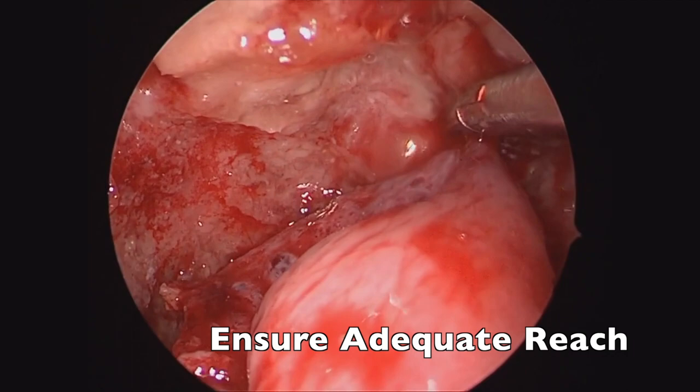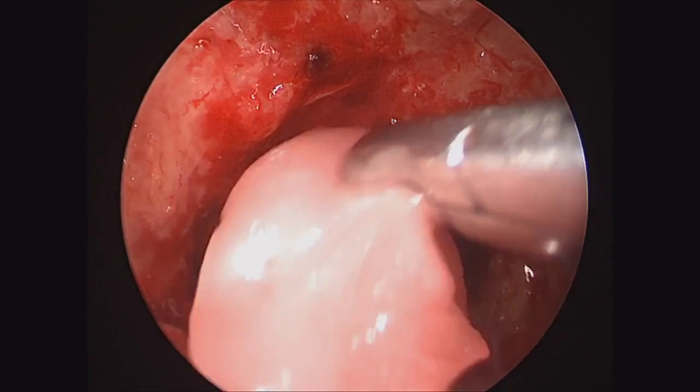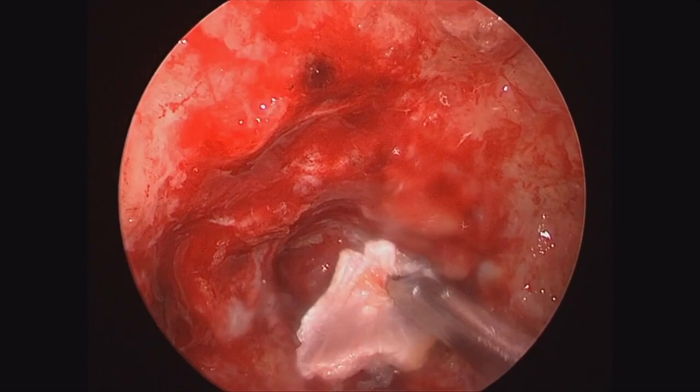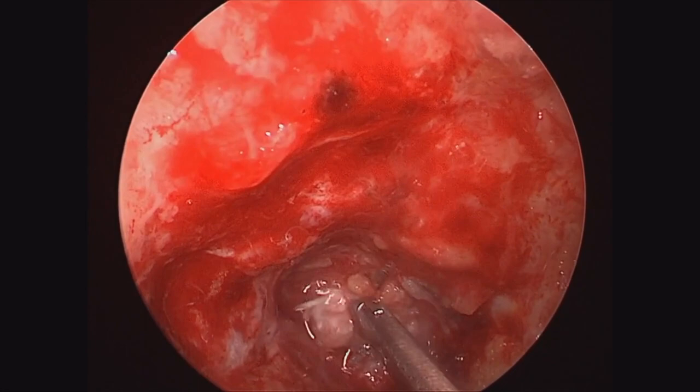Here we are just ensuring that it's going to reach our defect, which it will. Then we'll go ahead and place it into the nasal cavity or in the maxillary sinus for safekeeping while we work on the intradural work. Here's my neurosurgical partner, Dr. Van Gumpel, placing a Duragen inlay. We've already harvested our fascia lata, and we'll place that fascia lata in here as an inlay.